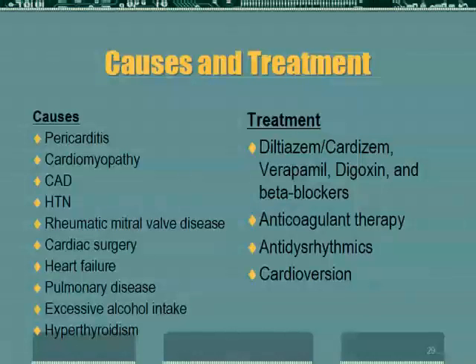Basically, cardioversion reprograms the heart. It'll almost look as if the patient is getting defibrillated. However, we set the defibrillator on a special mode for this. We put it on a synchronized mode so that it synchronizes with the R waves, and the patient is usually given fewer joules or shock potential with this particular treatment method. And what it does is it hopefully overrides what the atria are doing to get the patient's heart back into a normal sinus pattern and those types of things.